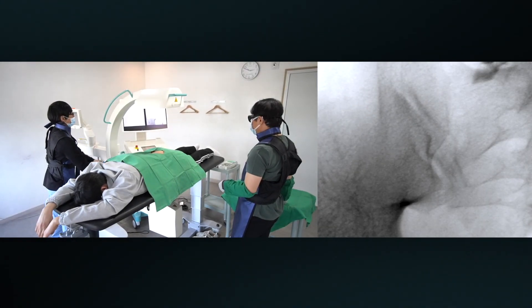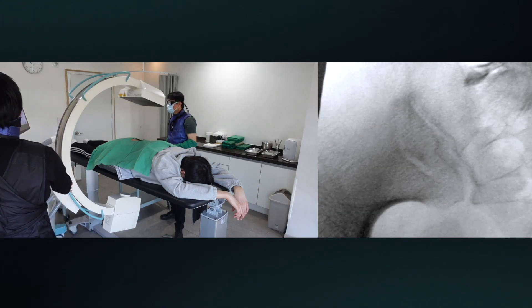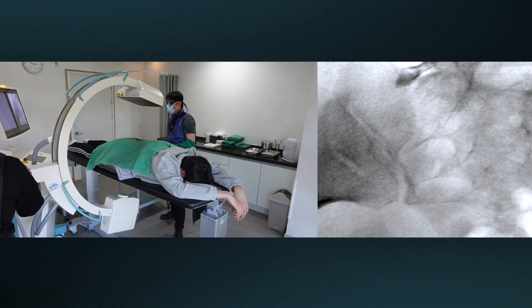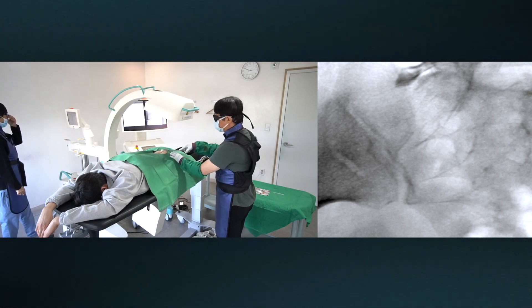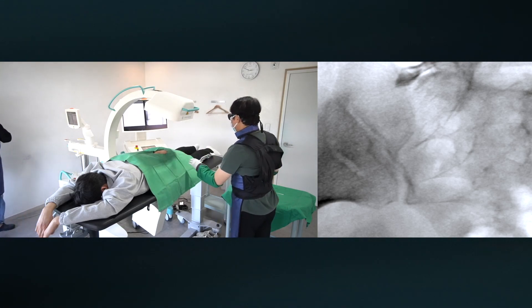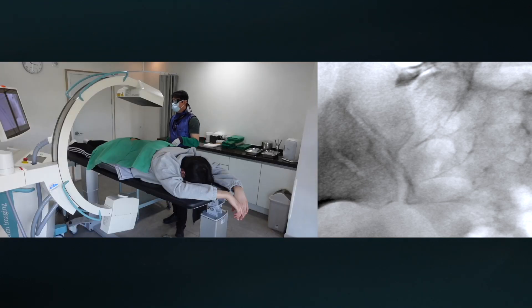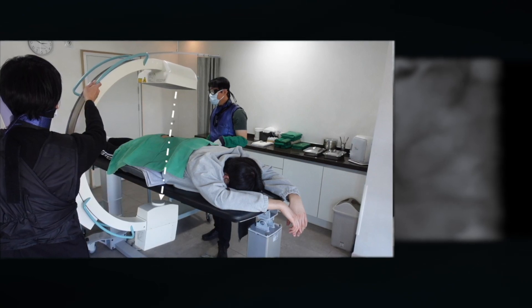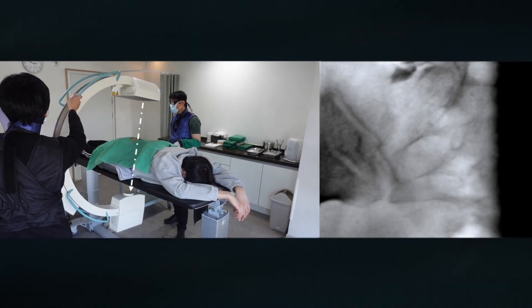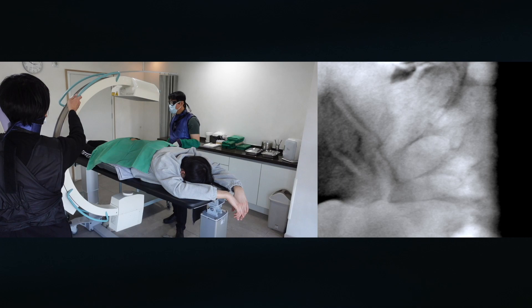Let's move on to the sacroiliac joint. The fastest and best way to have a successful SI joint arthrogram is to spend enough time on the observation period. My primary target is the inferior recess. I try to find the clear marginal line of the sacral side and exclude the overlying bone shadow. The left oblique view provides the optimal image in this patient. It is not always the same C-arm rotation view for all patients — some patients need an AP view and others require a right oblique view.